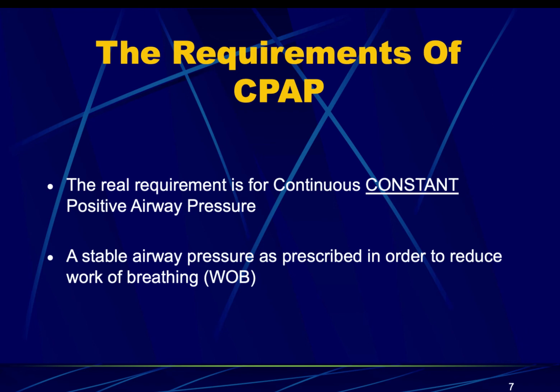Okay, so really what we're doing this for is continuous, constant, positive airway pressure, right? That's what CPAP really is. And stable airway pressure is prescribed in order to reduce the work of breathing. Okay, and I think this machine is great. I think it does wonders for our patients. I think it prevents paramedics from having to do intubations for some people, and that includes the hospitals as well.